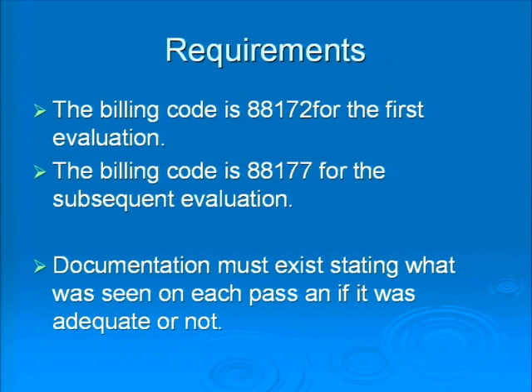Now, when you dictate, just like you do for your ultrasound, what you saw, the size of the nodule, calcifications, hypoechoic, vascular, all that, it's just as important when you dictate your note for your procedure that you say on pass 1, there are scant follicular cells and macrophages and colloid. Pass 2 had lymphocytes only. Pass 3 had adequate cellularity for Hurthle cells. So you have to document what you saw in each of the passes to give justification for why you did each sequential pass, okay?